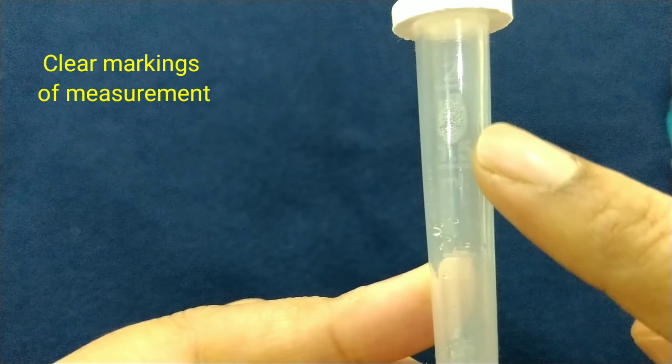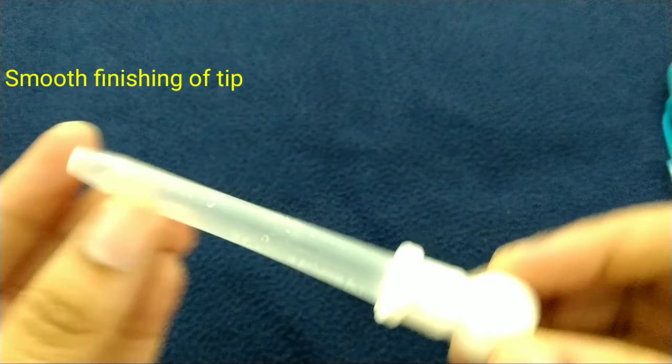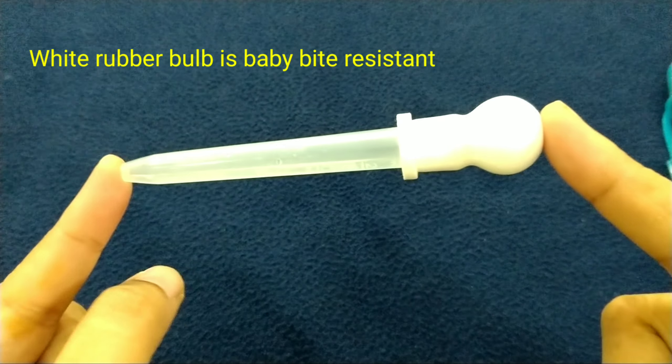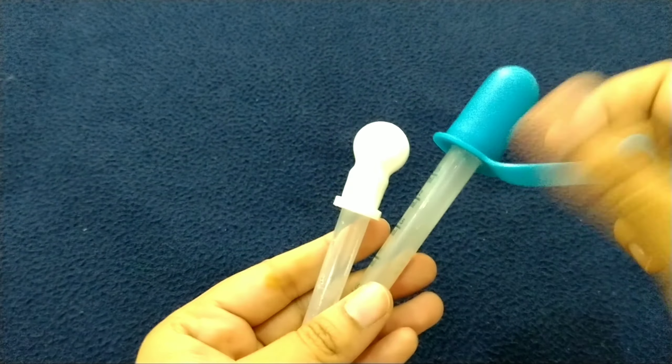The marking is very clear. It is very strong. It is very smooth — the tip is very smooth, so the baby is safe. The rubber bulb is bite resistant.